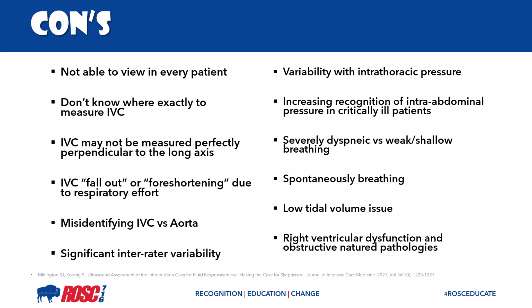And as with all heart-lung interactions, we need to worry about the low tidal volume issue. And then in addition, anything that would increase our right heart pressures. So maybe this could just be right heart failure, maybe it could be tamponade, PE, and so forth, can increase the size of the IVC itself.